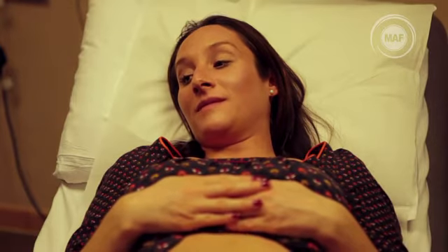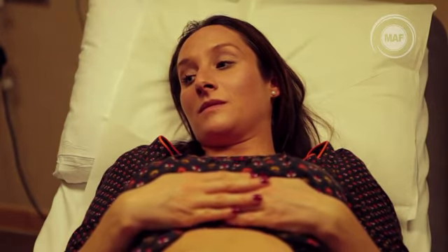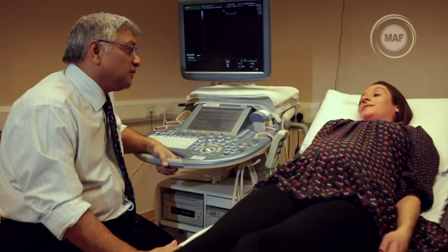Hi, my name is Raj. I'll be doing a scan. What we're going to do is measure the baby, the head, the body, the leg. We'll measure the fluid around the baby, see the blood supply to the umbilical cord and to the head, and then I'll go over the results with you. Okay?